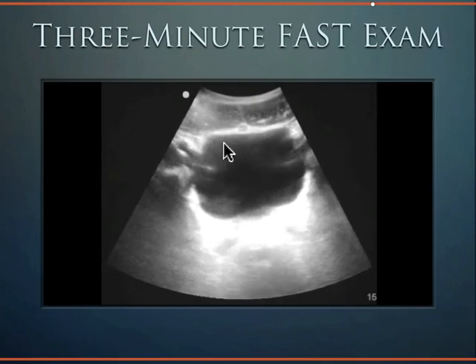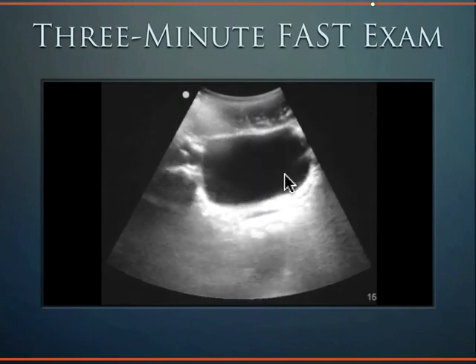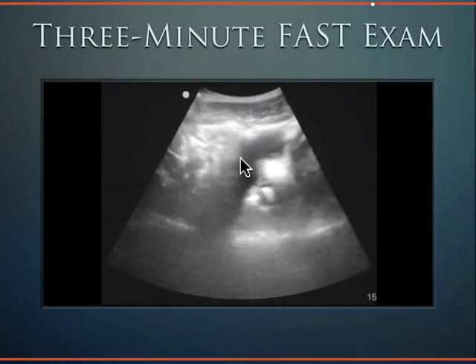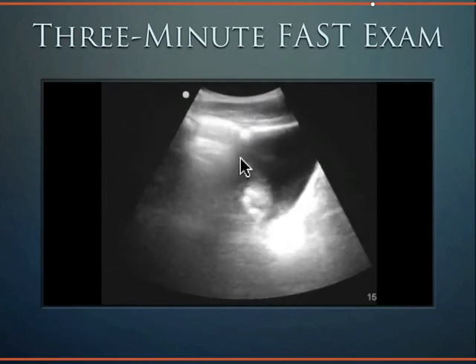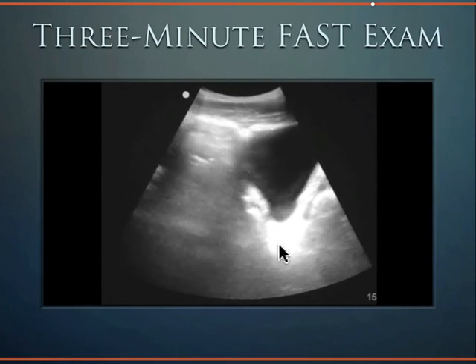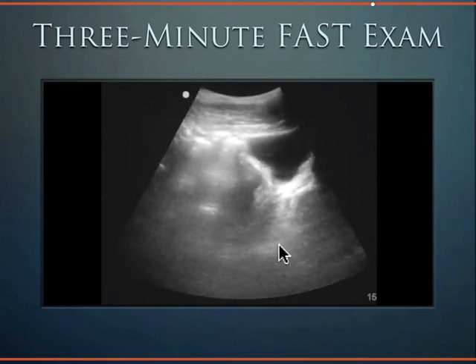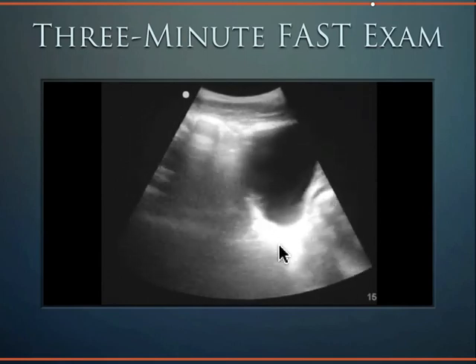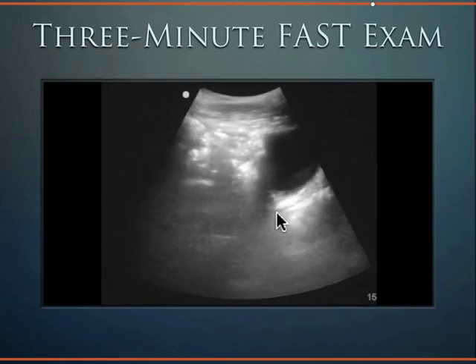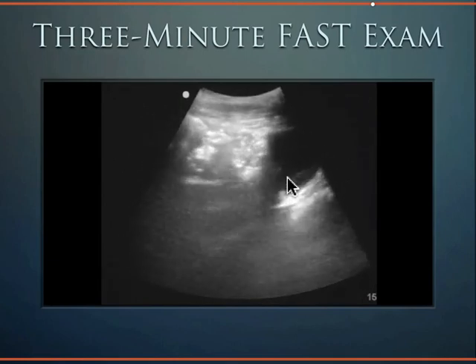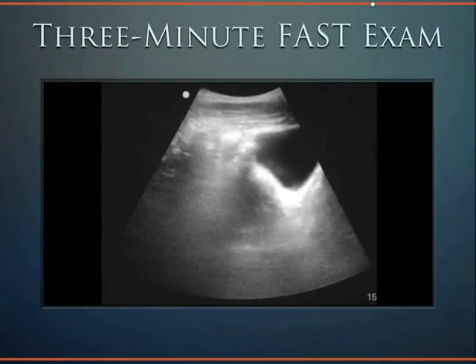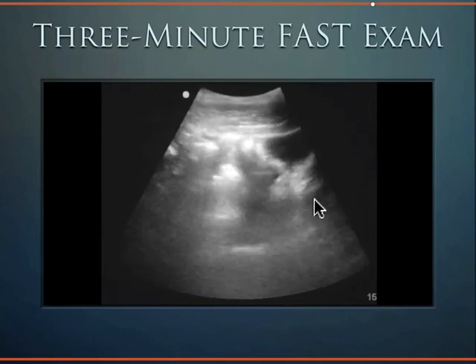Here we are fanning all the way through the bladder in a transverse view. Notice the bladder is a low attenuating structure, so structures posterior to it appear hyperechoic. Then, in the sagittal view, fan superior and inferior to obtain the entire window. The bladder is more triangular shaped in that sagittal view.